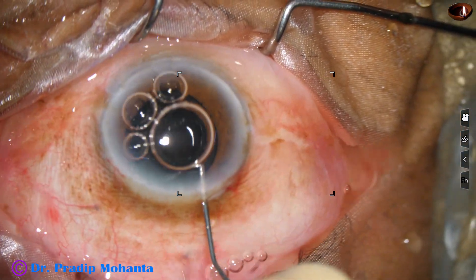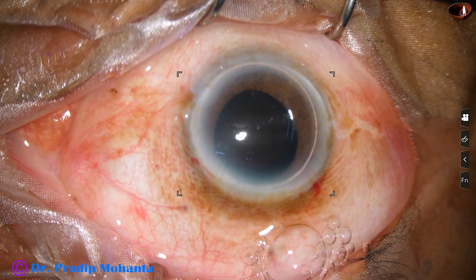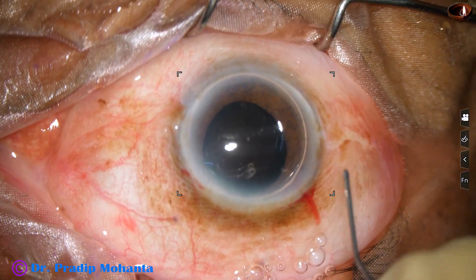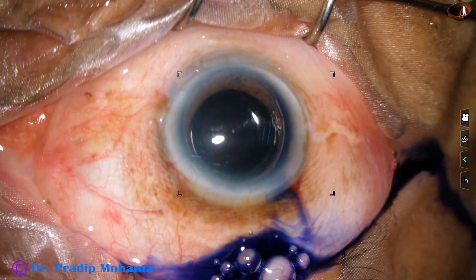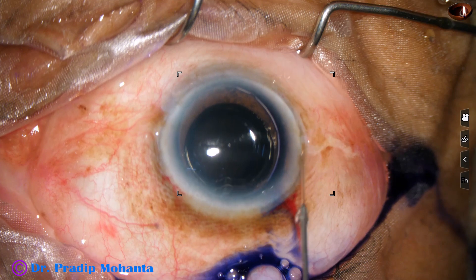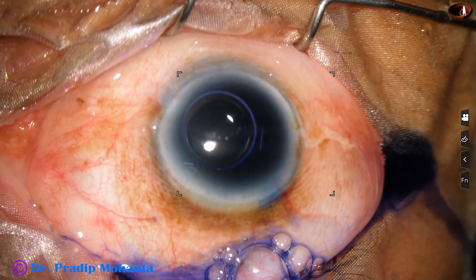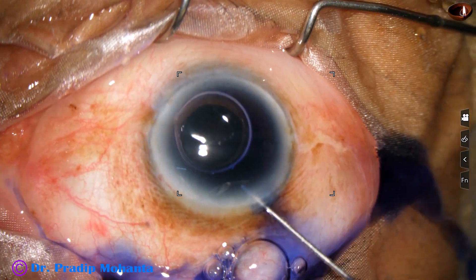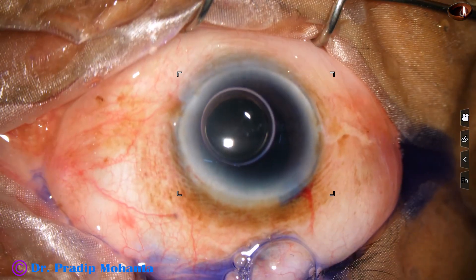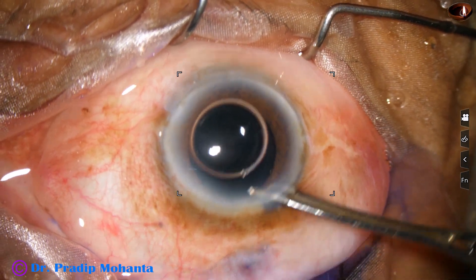The main incision has been made just posterior to the limbus. A side port has been made and an air bubble has been injected into the anterior chamber. Here goes the trypan blue dye to stain the anterior surface of the cataract — the anterior capsule. Adrenaline and phenylephrine are injected and the dye is washed out.